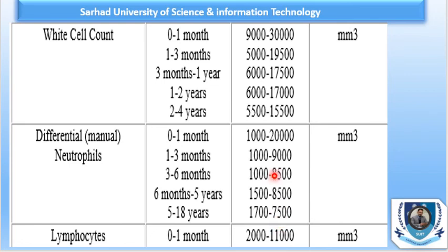While checking the report, the first thing is to check the age and sex, because it's the base of your report. If you know about this, then you will take a good diagnostic approach. If you miss this, then you will have a wrong report, and the patient will get wrong medication as well. So it's all about the CBC reports.